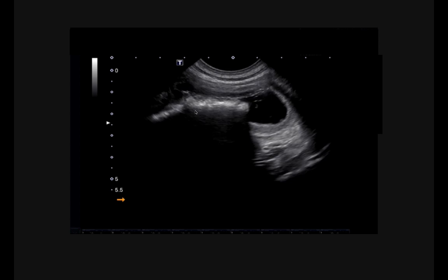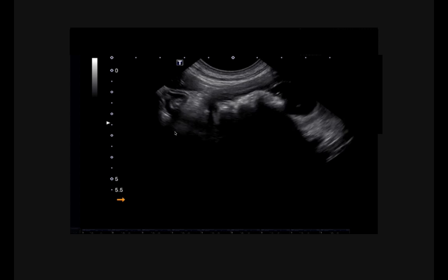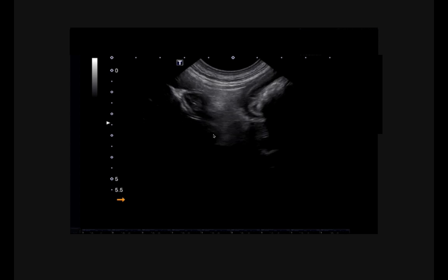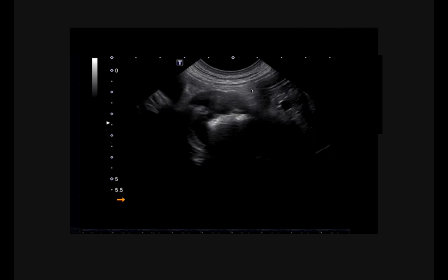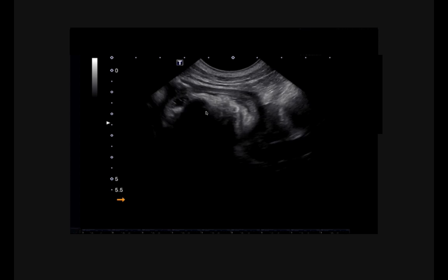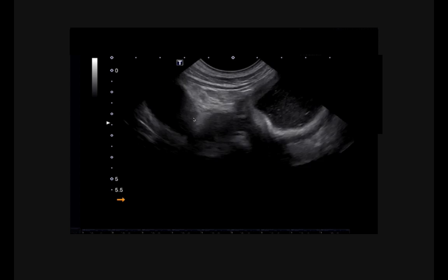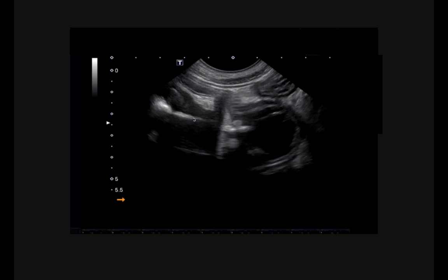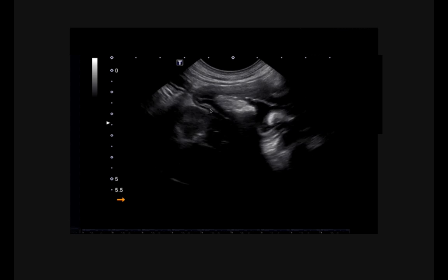It is then difficult to follow the foreign material, as we will follow it through the GI tract, keep comparing the affected bowel segment with the adjacent normal bowel segments. Here's the foreign material. It's a large amount of it, surrounded by fluid accumulation. In places the fat around the affected segment appears slightly increased in echogenicity.